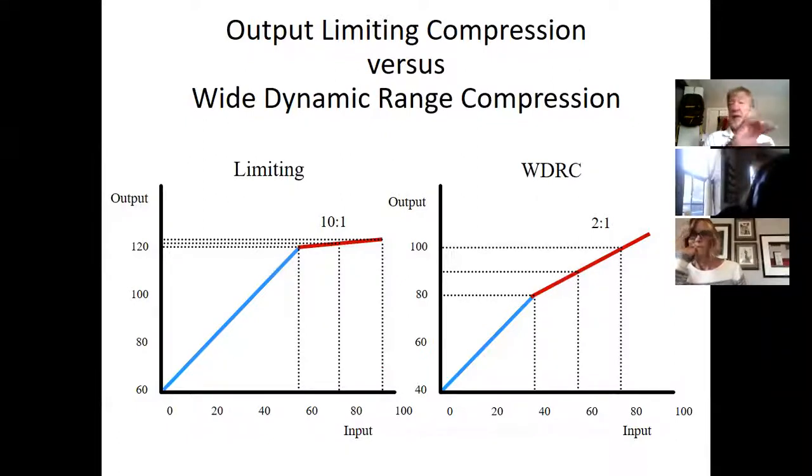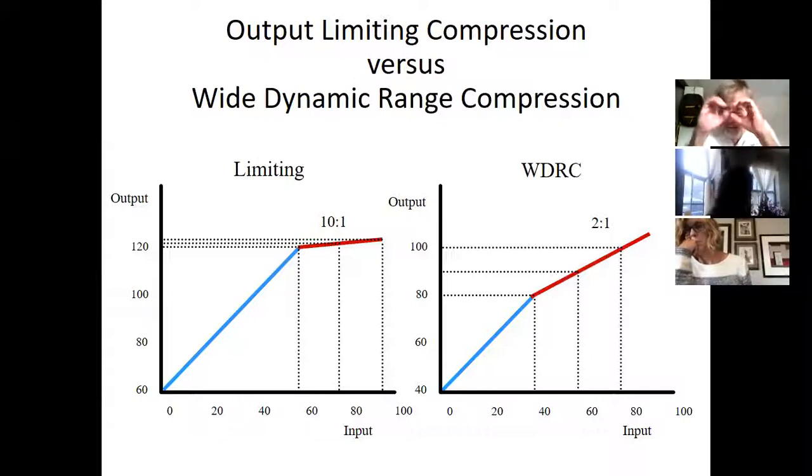So the person with a left corner audiogram or a flat hearing loss of 80 decibels is going to be wearing high power hearing aids, and he wants compression, but the focus of this compression isn't on elevating the floor. The focus of this particular compression is that we need to protect this client from further hearing loss. How are we going to do it?